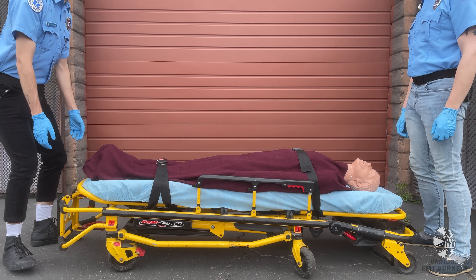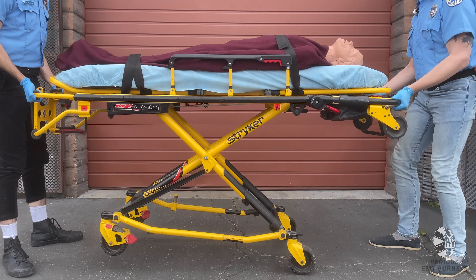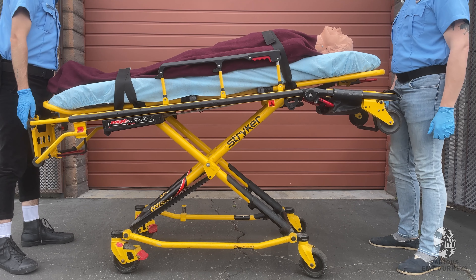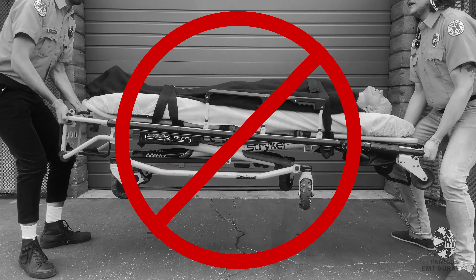To raise the gurney from the folded position, pull and hold the release lever before lifting the gurney. Let go of the release lever to lock the undercarriage. Do not pull the lever if the wheels are off the ground, or the undercarriage will drop.